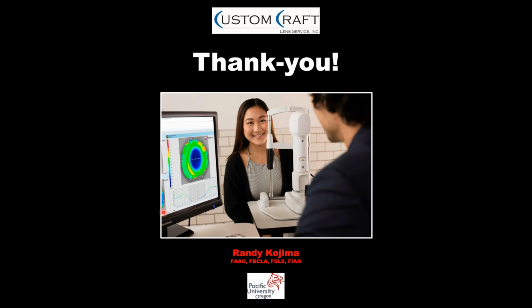But when you're constructing the lens, you want to take a bunch of maps on the geometric capture. So you might take 4 maps on the visual axis and 4 maps on the geometric. Pick your best one, and then you can delete the others once you get the fit started, once you're comfortable that you have good quality topography. So when in doubt, take plenty. Take boatloads of pre-ortho-K maps, and that way you're assured that at least one of them has to be good.